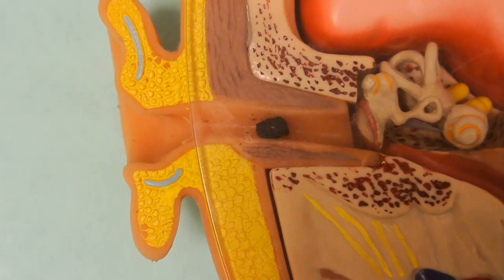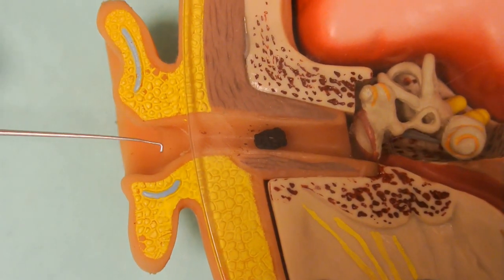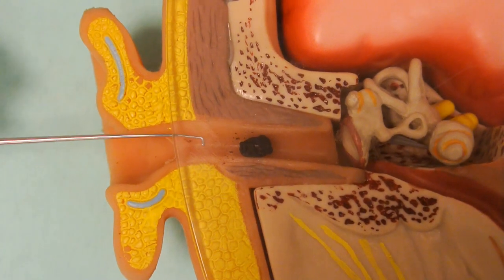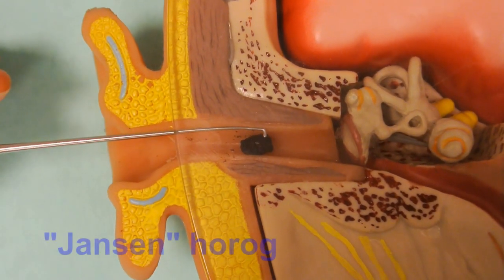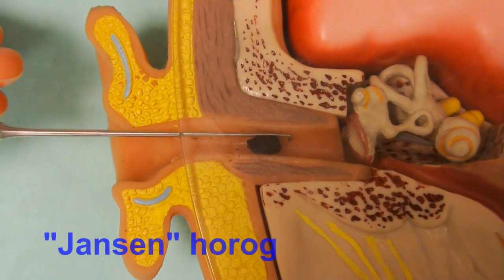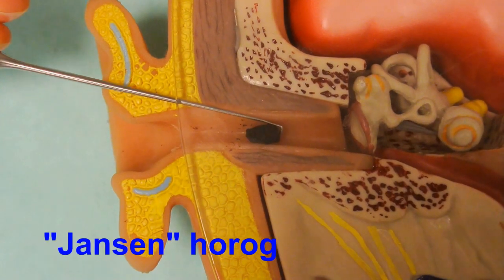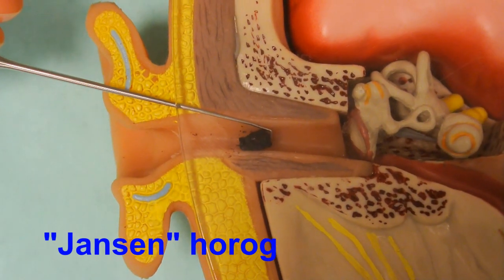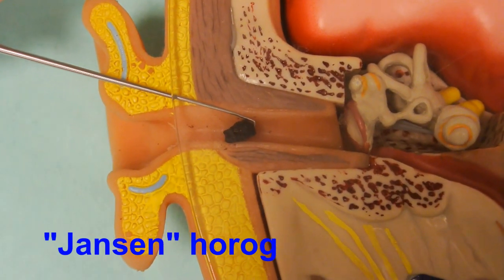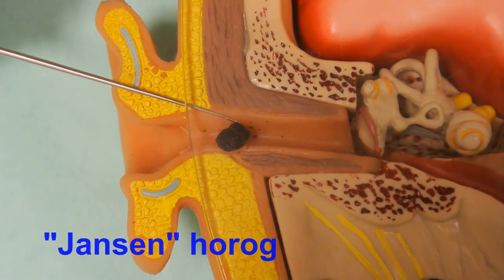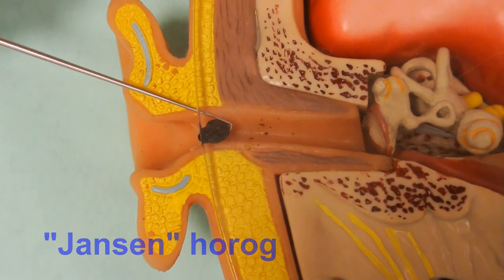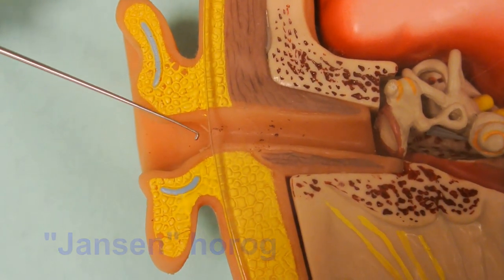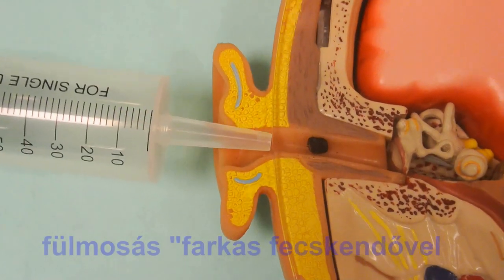Jansen hook is also good for removing wax, especially when the wax is hard in consistency. With this tool, the likelihood of hurting and causing injury to the ear canal is minimal.